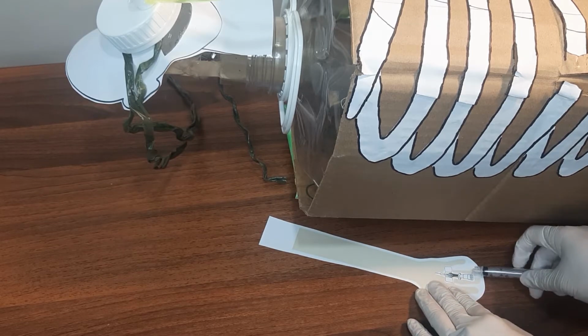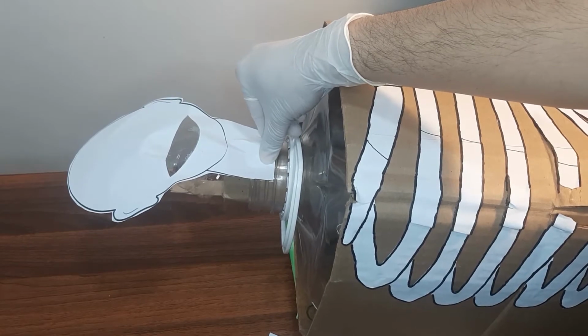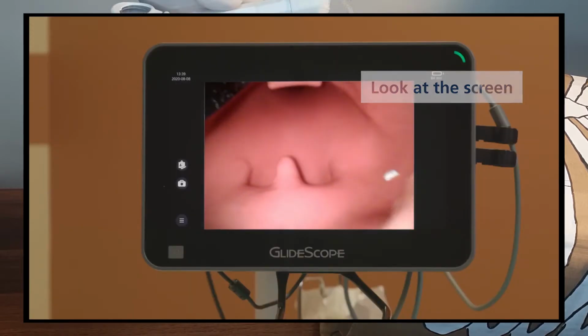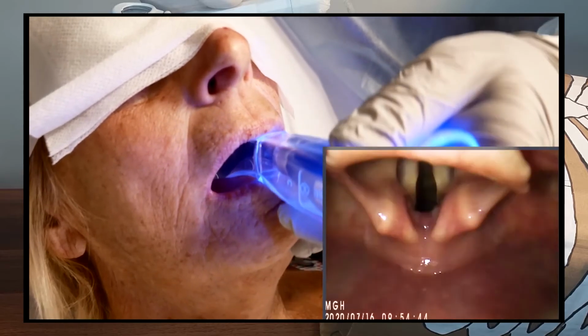Once the patient has been fasciculated and relaxed, increase cricoid pressure to 30 newtons or approximately 3 kg and proceed to intubation. Due to obesity, video laryngoscopy is the method of choice. If not available or due to physician's choice, direct laryngoscopy can be used.